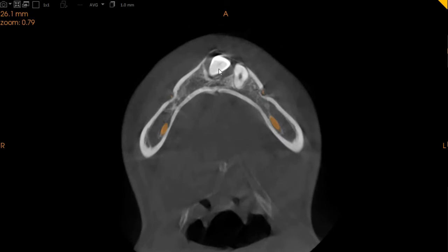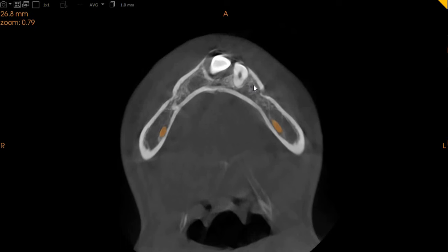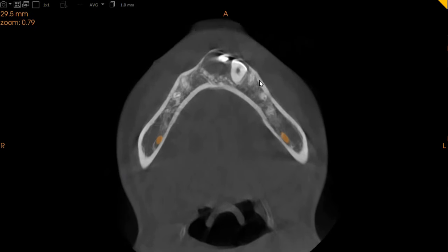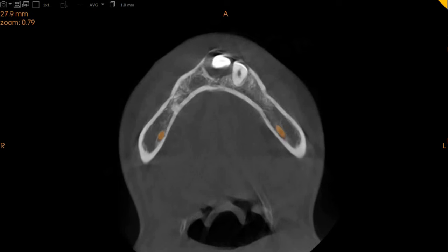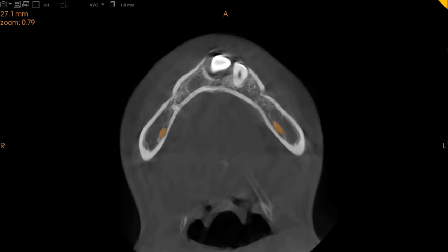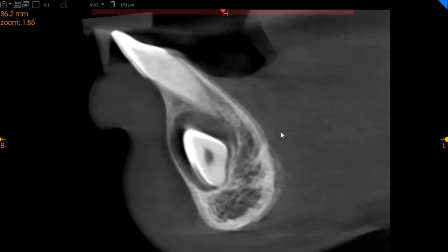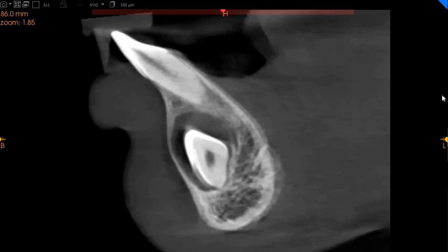This is the lower right canine. It has a radiolucency around it. It could be a cyst, it could be a tumor, or it could be a tumor-like lesion — but because of its nature and how the radiolucency is around the crown structure of the tooth, we would assume that this is a tentative dentigerous cyst around this tooth.